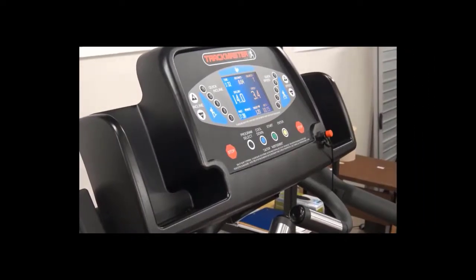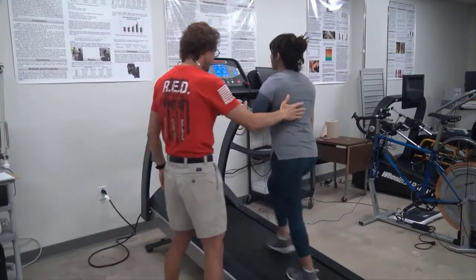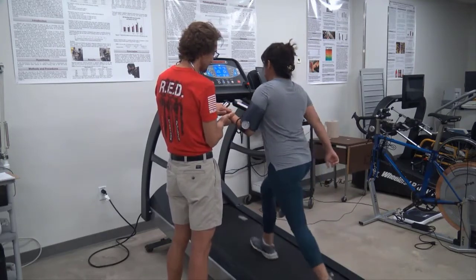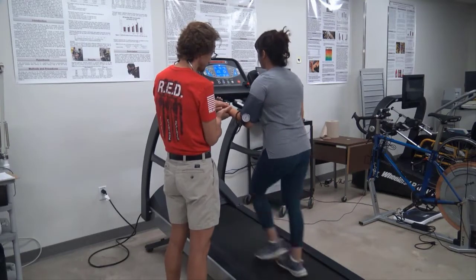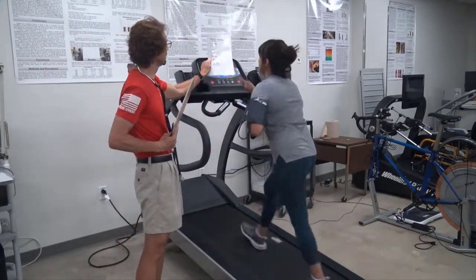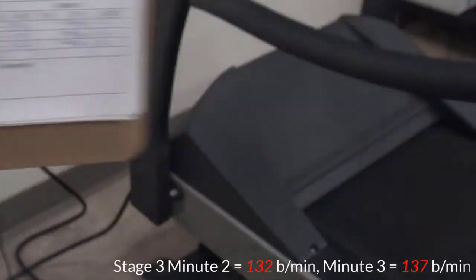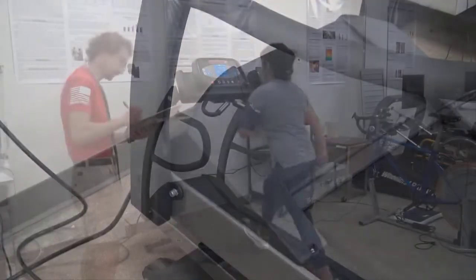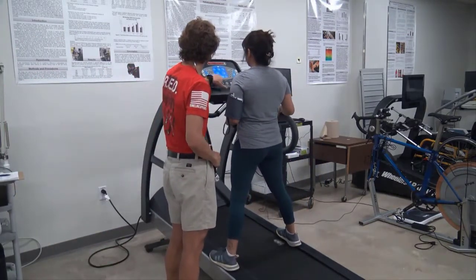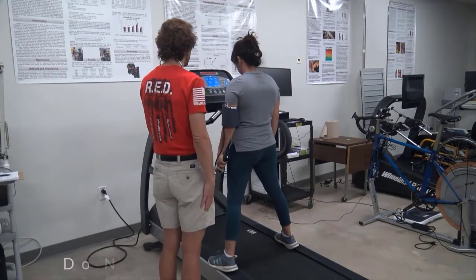The speed for stage 3 is 3.4 miles per hour with a 14% grade. Some clients, depending on their size, may feel compelled to jog in stage 3, but remind them that this is a walking protocol. Continue to monitor the client and measure heart rates at the end of each minute as in the previous stages. The client had a heart rate of 126 beats per minute in minute 1, 132 in minute 2, and 137 in minute 3 of the third stage. Since there was no more than a 5-beat increase from minute 2 to minute 3, that is considered steady state. Since the standardized procedure states we should not proceed to the next stage if steady-state heart rate is 135 beats per minute or more, the test is now finished.